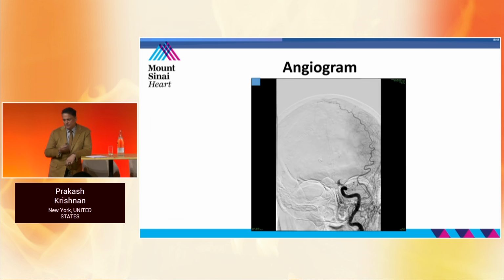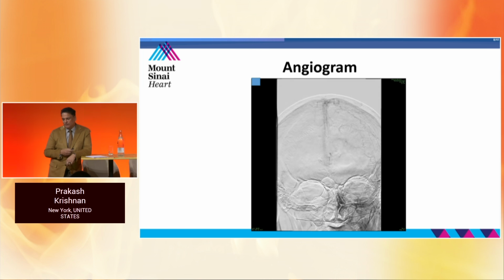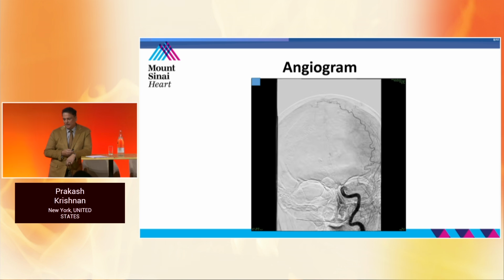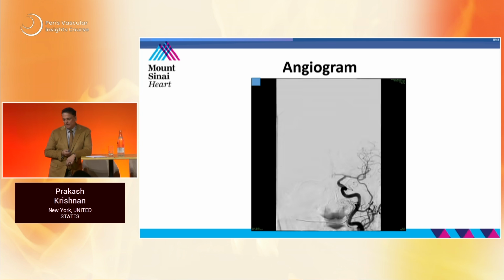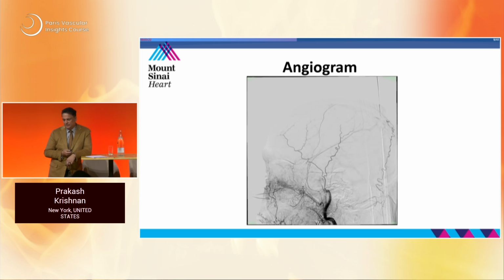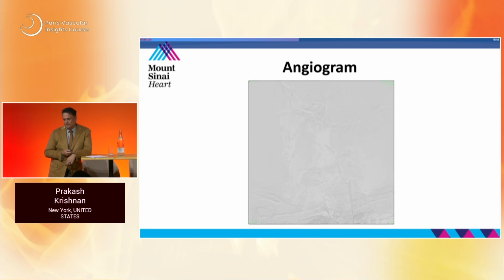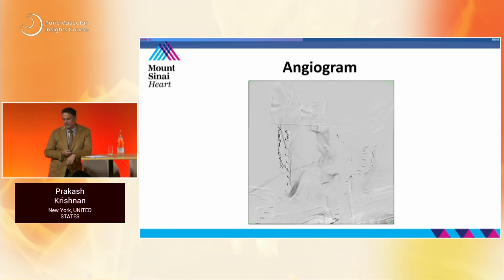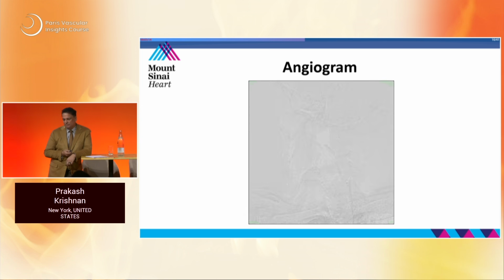You can see this confirmed the CT angio findings of contralateral filling of the brain from the contralateral carotid, and you can see the competitive flow very, very clearly. So since we had the pre-op imaging, we went ahead, and this is obviously the lateral shot and the Towne's view as well that you just saw. So then we went ahead and placed our filter, and we did our pre-dilatation followed by stent placement.